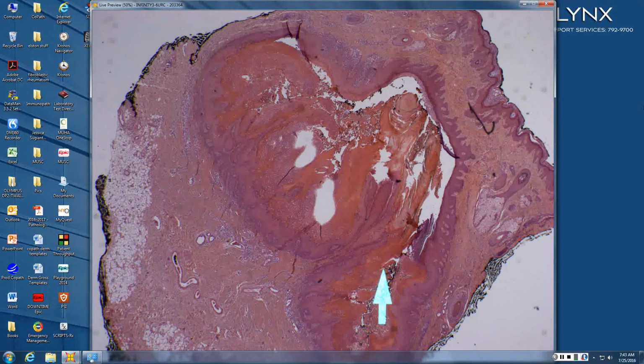Blake. Looks cystic in nature, and in a chapter composed of cysts and acanthomas, you had about a 50-50. Go ahead. There's like a thick eosinophilic debris inside the cystic wall. Yeah, so the debris is not amorphous debris, but probably keratin, and the nature of the keratin is helpful.